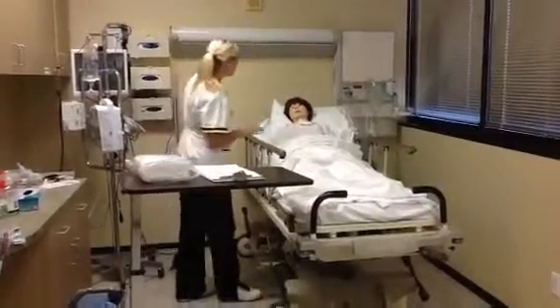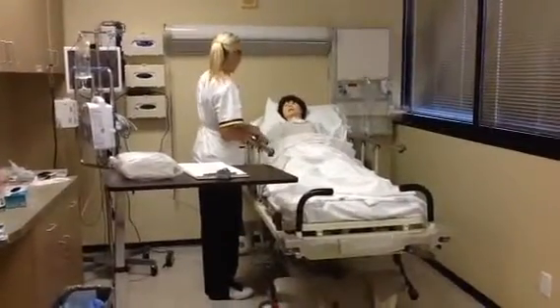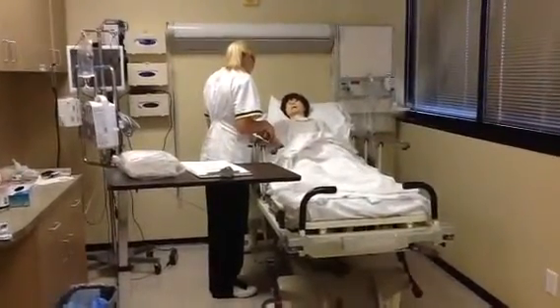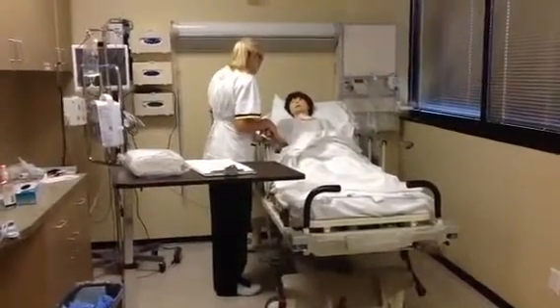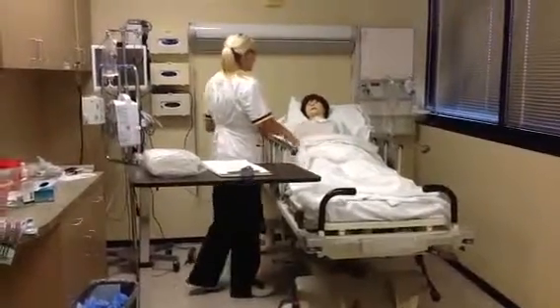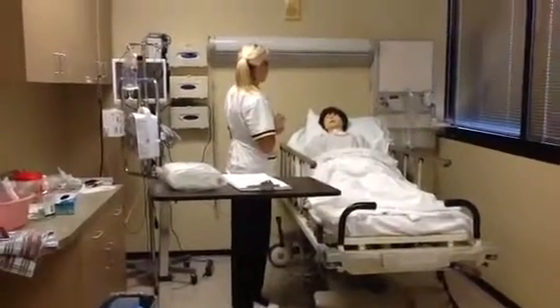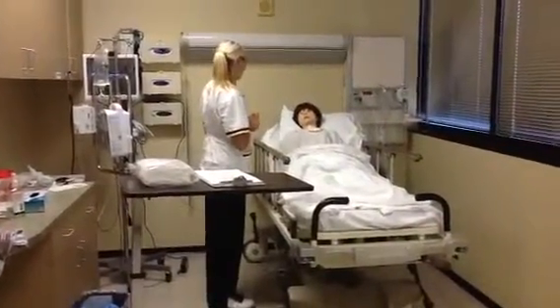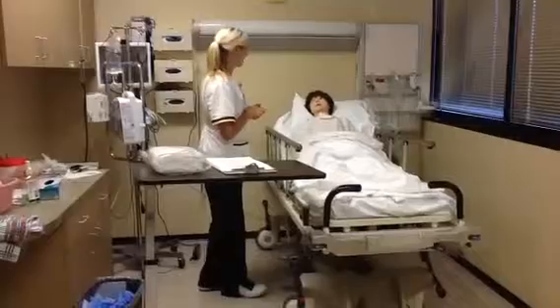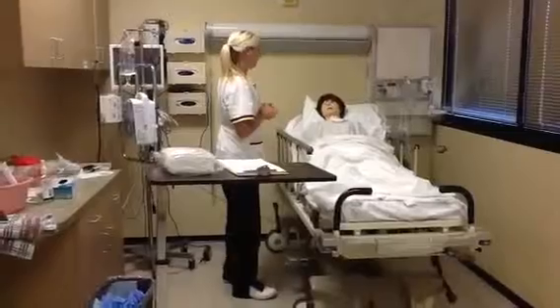Knock, knock, knock. Hi, Mrs. Knight. My name is Shelby, and I'll be your nurse today. Can you please verify your name and date of birth? Okay, I see Mrs. Knight, 8/8/1939, and I do see that you're allergic to penicillin, latex, and betadine, so we'll make sure that none of that is involved and make sure you're okay with that. But I have heard that you've had problems going to the bathroom and urinating, so the doctor has ordered a Foley catheter for you, so I'm going to go ahead and insert that today. But to begin, I'm going to assess the area and make sure that everything's okay and that I can insert the Foley catheter.